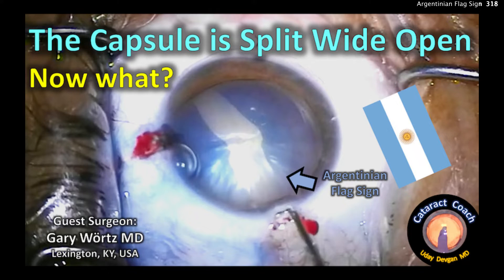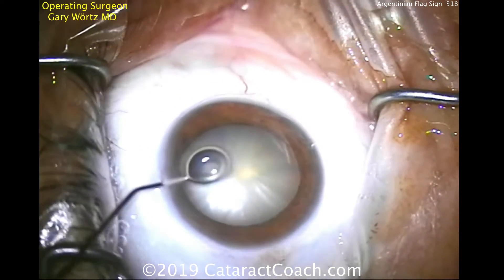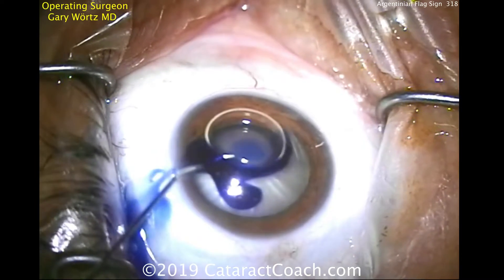CataractCoach.com. The capsule is split wide open — that's the Argentinian flag sign. What are we going to do now? Our guest surgeon is Dr. Gary Wartz from Kentucky, USA, and he has a patient with an intumescent white cataract.